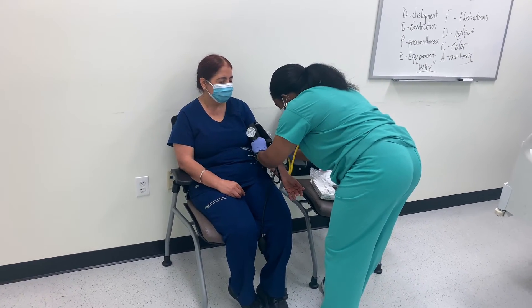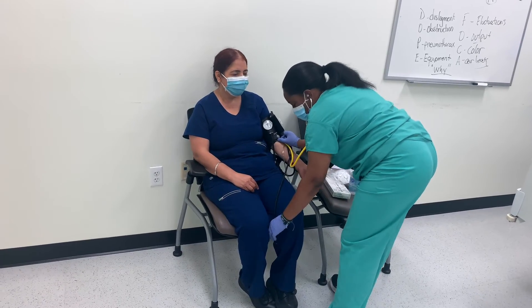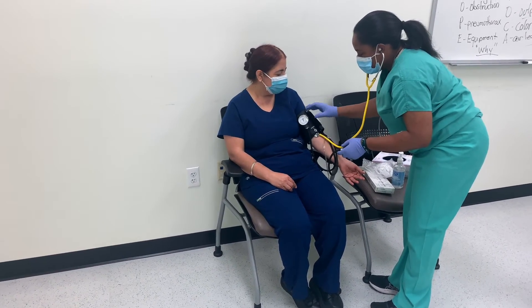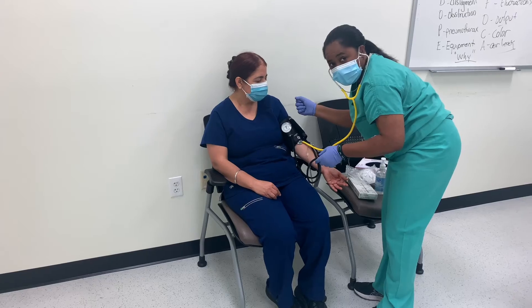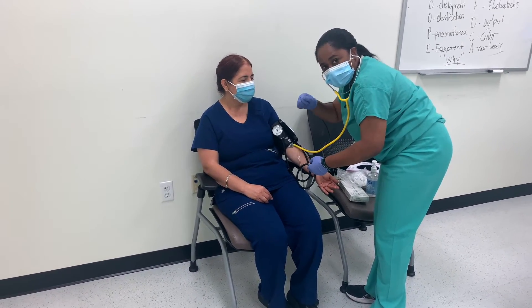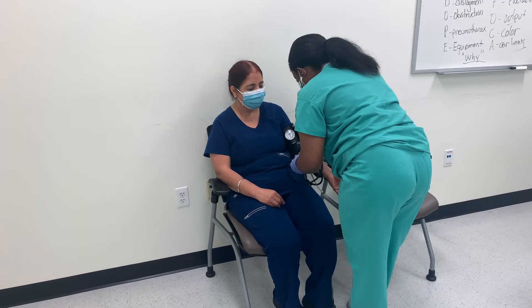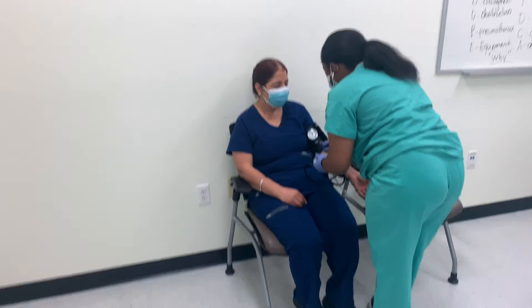So we already know I'm going to be pumping her at 130. Now I'm going to take her actual blood pressure. I'll make sure I'm placing my stethoscope where I felt her brachial pulse. I'm paying attention because the systolic pressure is going to be when I first hear the sound, and when I release pressure and stop hearing the sound, that will be my diastolic pressure. So I'm going to go ahead and pump all the way up to 130.